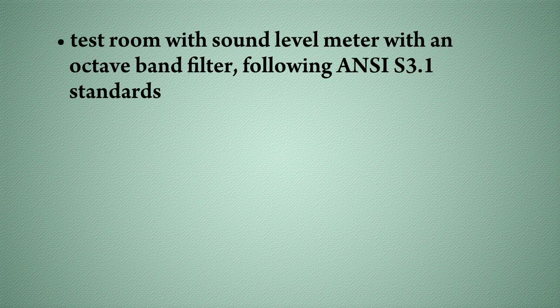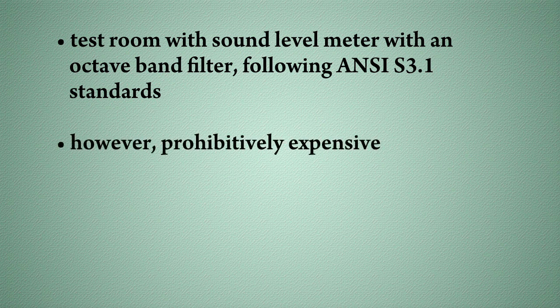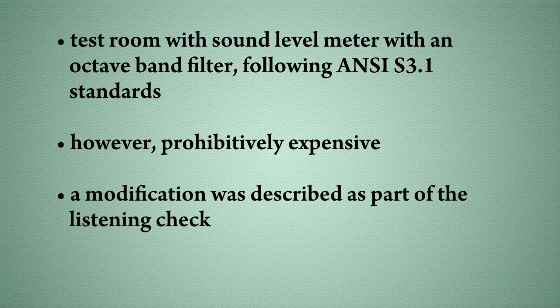The best practice for hearing screening is for the screener to test the room using a sound level meter with an octave band filter following American National Standards Institute, ANSI, S3.1 standards. However, this is prohibitively expensive for most school systems. Instead, ANSI standards have psychoacoustic procedures for checking background noise. A modification of these procedures was described as part of the listening check.